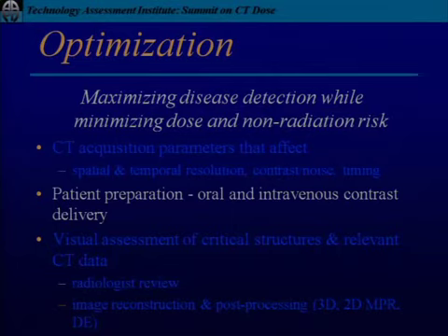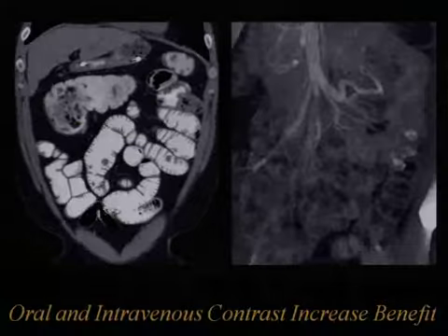Patient preparation. Okay, this talks about some of the things that you may not be familiar with if you're a physicist in terms of oral and IV contrast delivery.